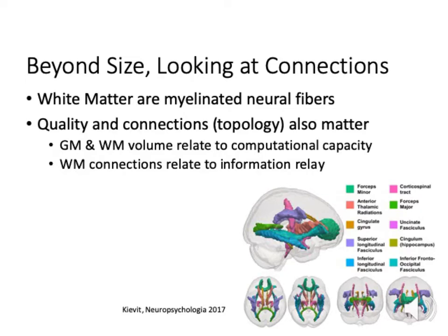In this second part of my talk, I will explain the steps to perform neurofiber analysis. As useful as volume and cortical thickness analysis was, these are simply no longer enough to characterize the changes that occur due to development, neurodegeneration, or neurodisease onset. We must also look at both the quality and the type of connections, or the topology, that are made.